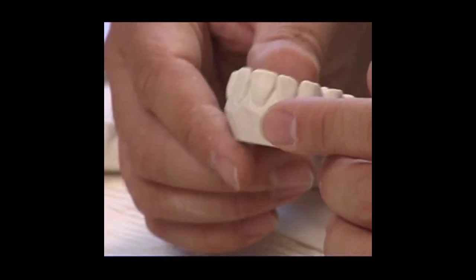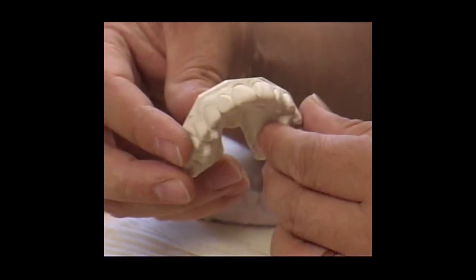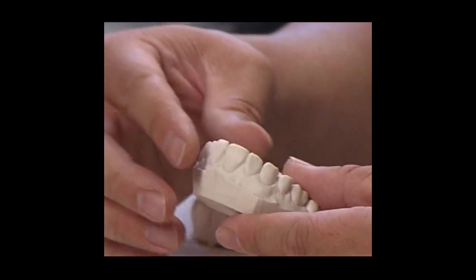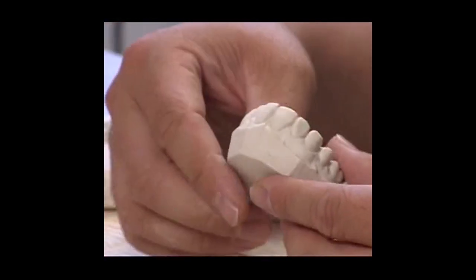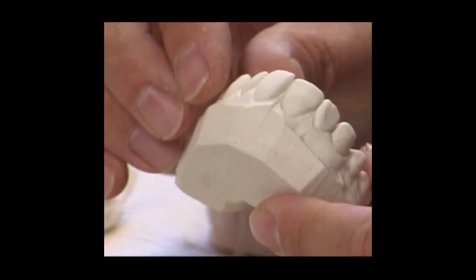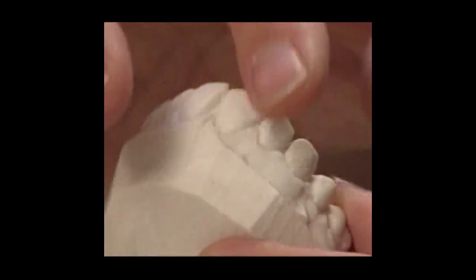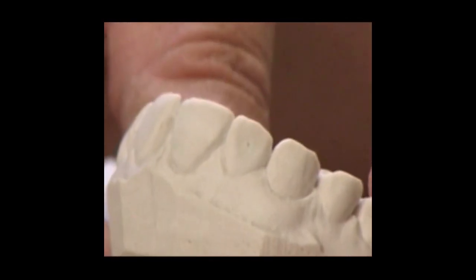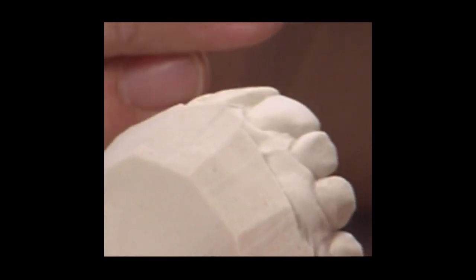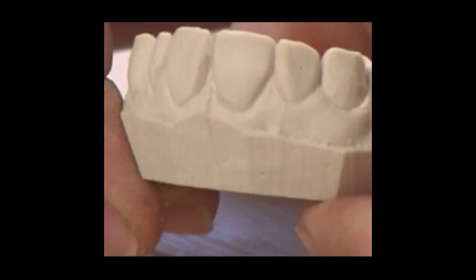Here's a case for Evelyn Mercer, as you've seen before. Now I have to make a mock-up with the composite to prepare for the temporary fabrication. What I'm going to do is use the composite, with a little bit of touch-up on the surface of the stone to create the arch, and apply the composite over the top to prepare for the temporary. Then we're going to have a suck-down, which is a clear stent, to make the temporary.